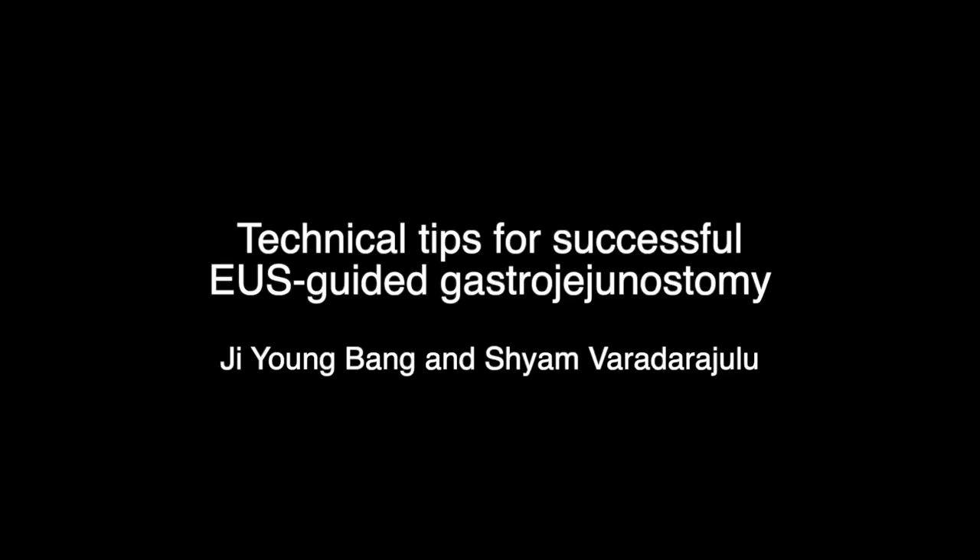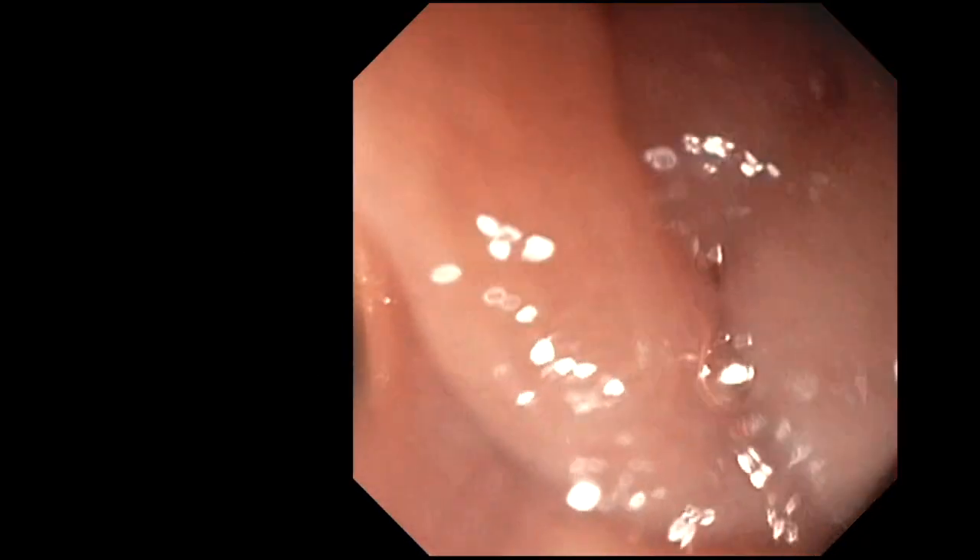In this video, we'll be sharing the technical tips for successful EUS-guided gastrojejunostomy. This procedure was performed in a 68-year-old female with gastric outlet obstruction resulting from unresectable adenocarcinoma of the head of the pancreas.